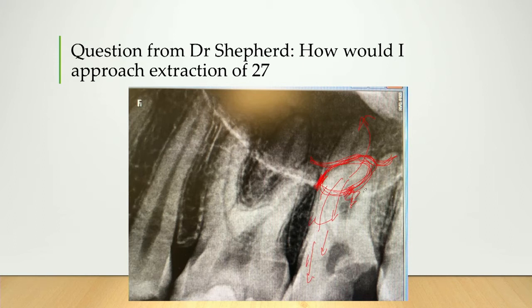I'd be wary, if you're a beginner at surgical extractions, about trying to fish that root, because it's very, very easy to just press too hard with your luxator. It's just soft tissue here. There's no resistance at all. If you push up, then basically the tooth root will pop in. How I do it is basically with very, very little upwards pressure. So I don't luxate up, so that the root doesn't pop into the sinus.